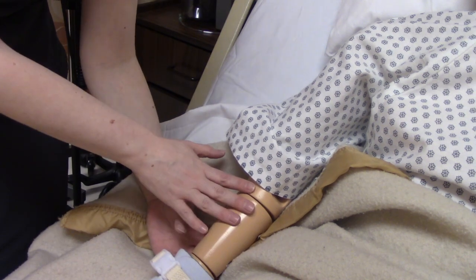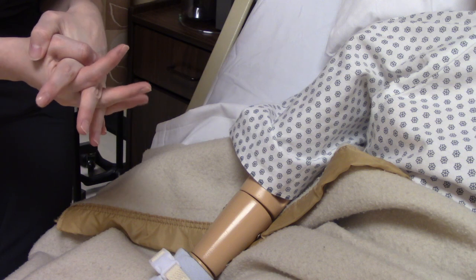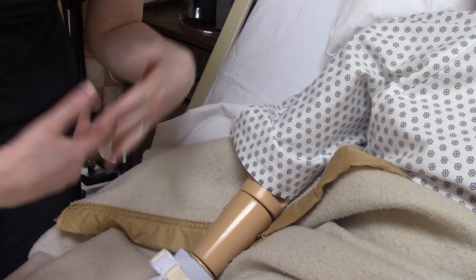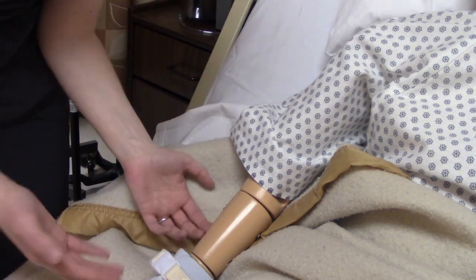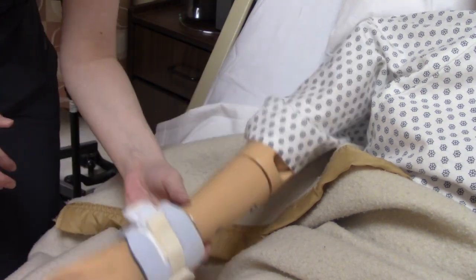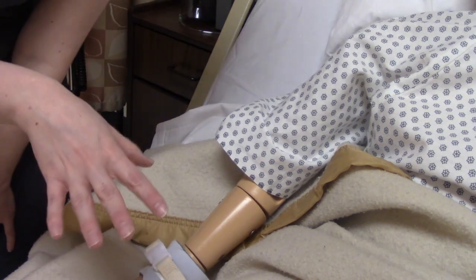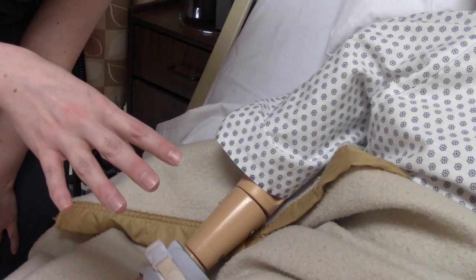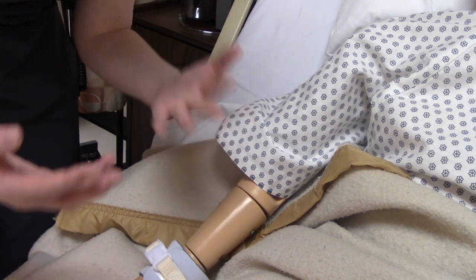We need to address nutrition and hydration — have they eaten, do we need to help them eat, can we give them a little break from the restraints so that they can eat? What about going to the bathroom — do we need to give them a break so we can help them? We also need to do range of motion exercises. Most places have policies about that — typically every two hours you take the patient off restraints, give them a limb break and do range of motion exercises on that area, though this will vary depending on where you work.